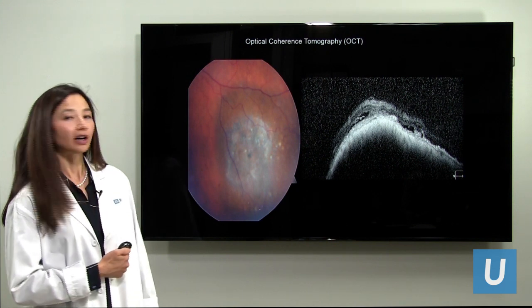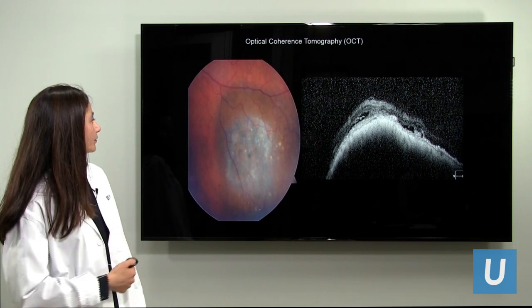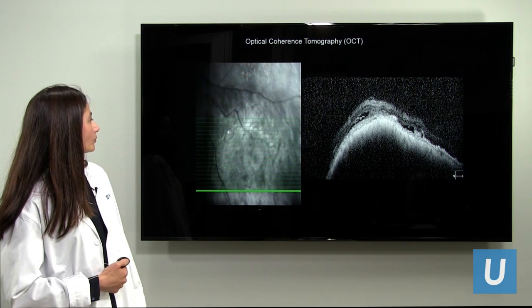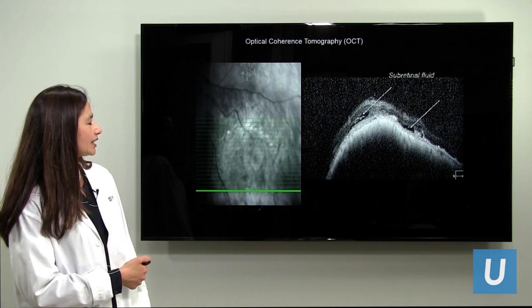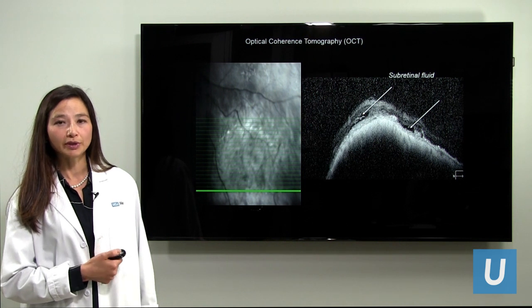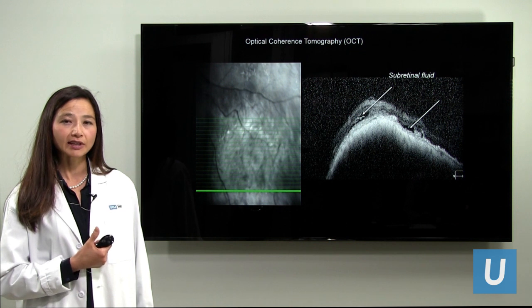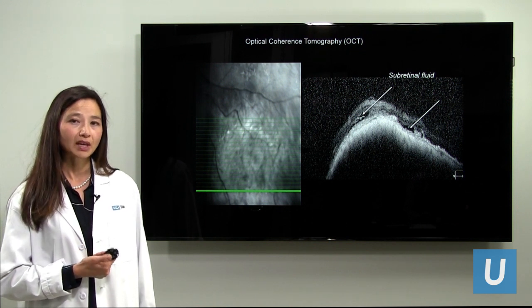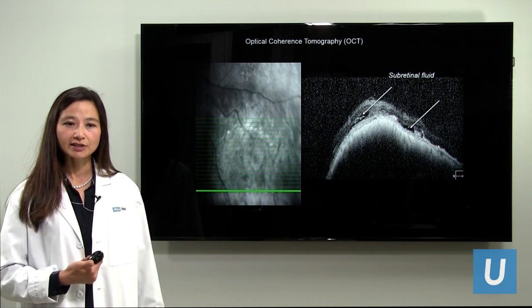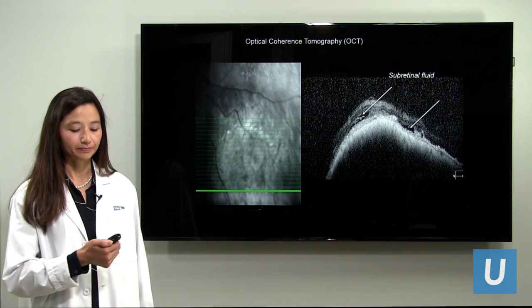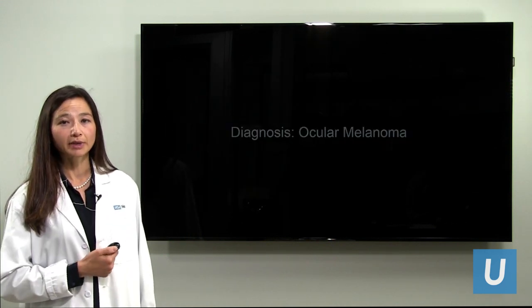Optical coherence tomography shows the melanoma, and scanning through we can see areas of subretinal fluid to the right. Fluid is a sign of activity because active cancer cells are leaking fluid. In a larger melanoma, the fluid is much more extensive and constitutes a retinal detachment. The diagnosis here is ocular melanoma.